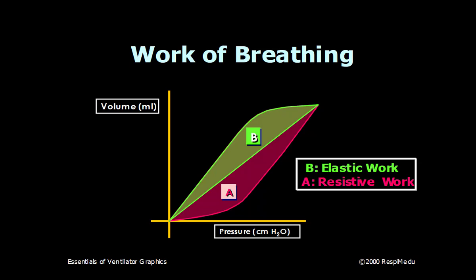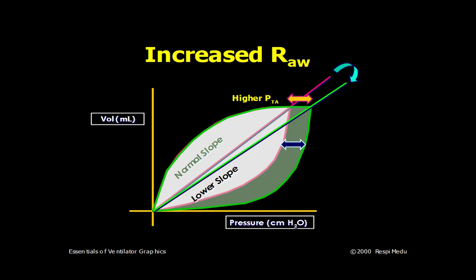So when you talk about work of breathing, this is the resistive work, this is the elastic work. Increased resistance means, first of all, higher pressures and more of resistive work as compared to elastic work. So more amount of resistive work.